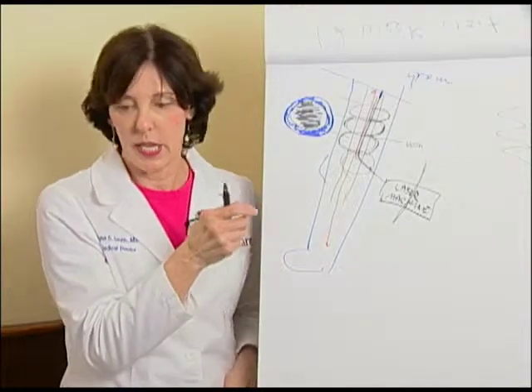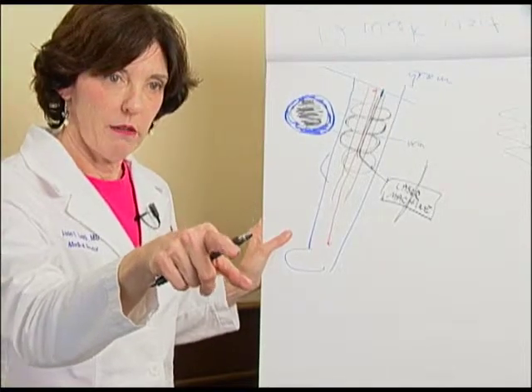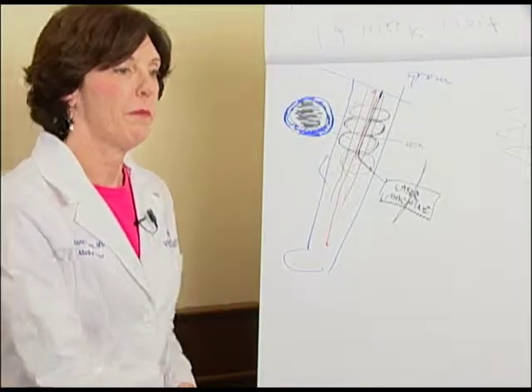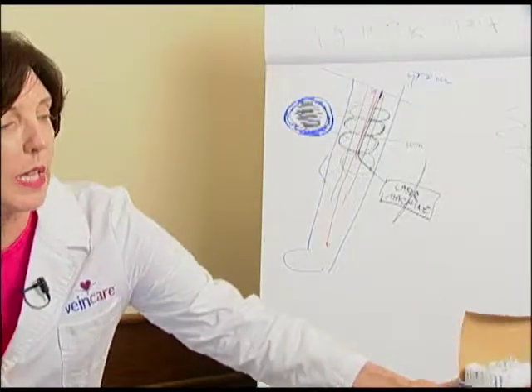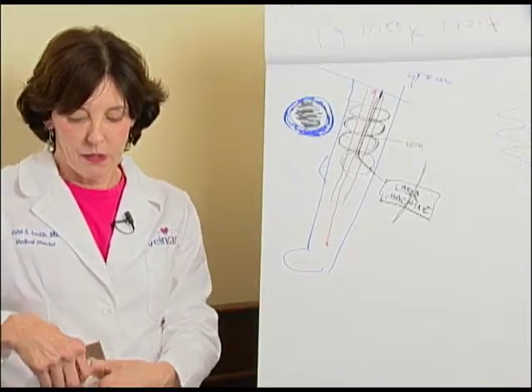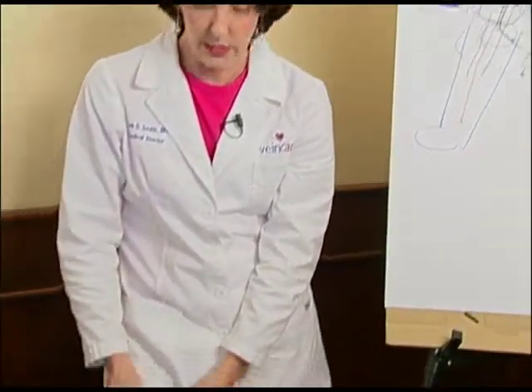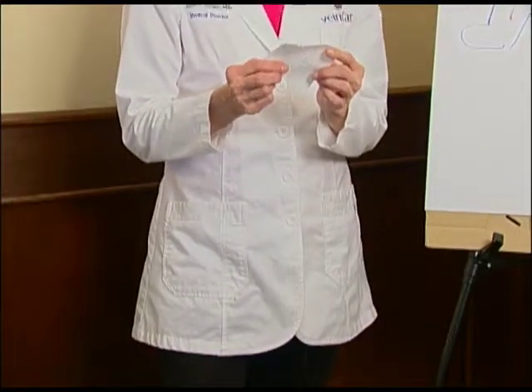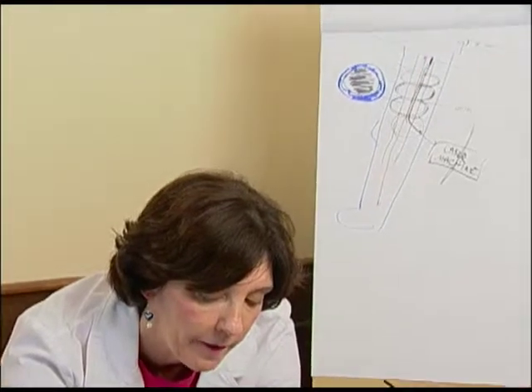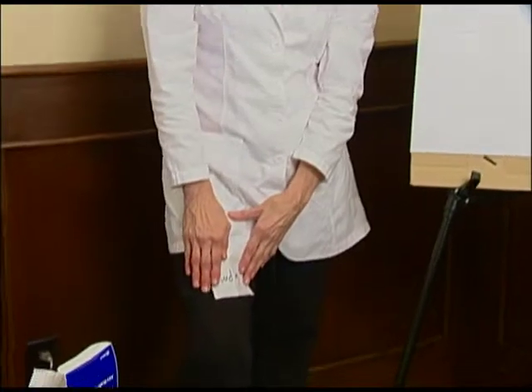But we will put a dressing on it. If you can hand me the next one there, you probably know what 4x4s are. That's what I need. Essentially we'll put just a little bit of dressing on, and then we adhere it with this. Now, right on that, we will put the time when we want you to remove it, and we'll do it so it faces you, okay?